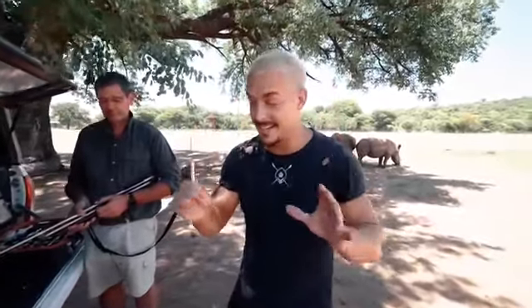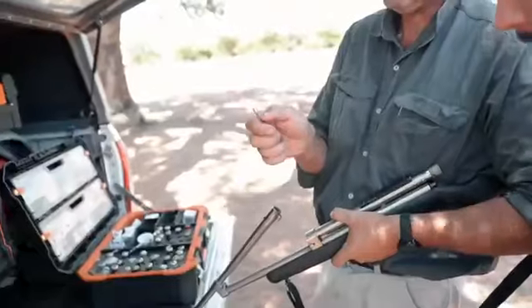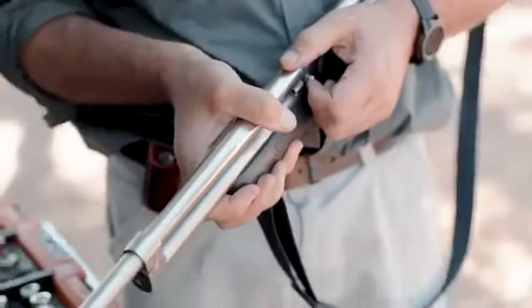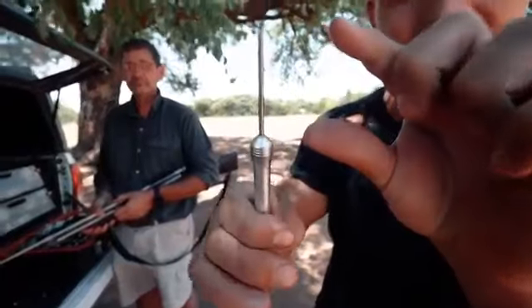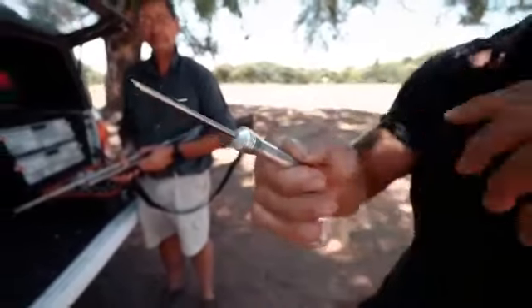This is so exciting — we are about to tranquilize a white rhino female right now with this dart. It might look a little bit brutal because of the big needle, but keep in mind the skin of the white rhino can get as thick as five centimeters, so they need a needle like this to be able to enter that skin and release the tranquilizer to make the animal fall asleep.